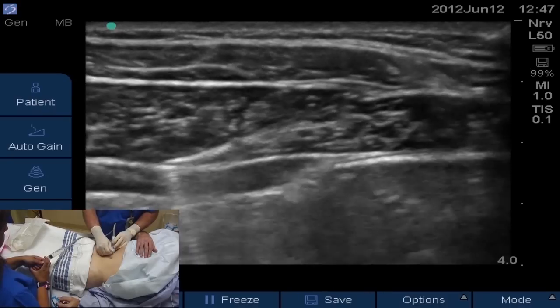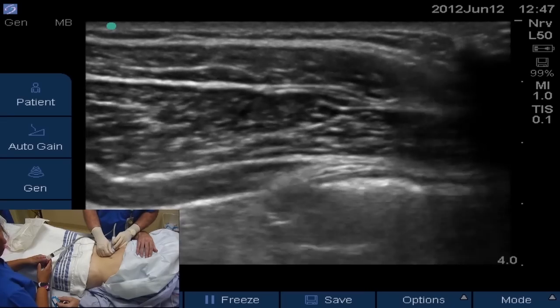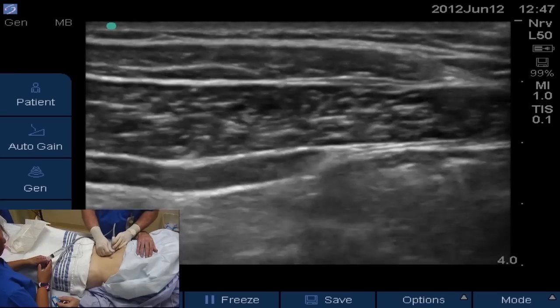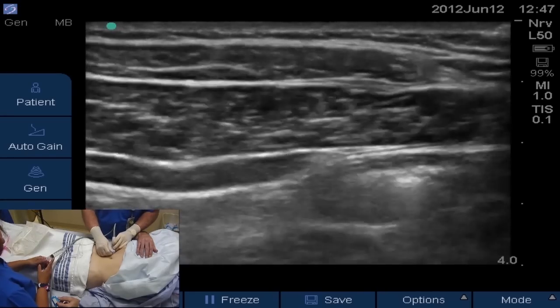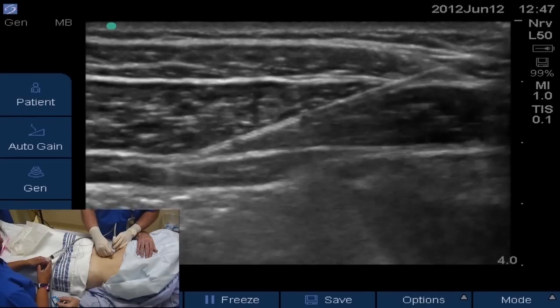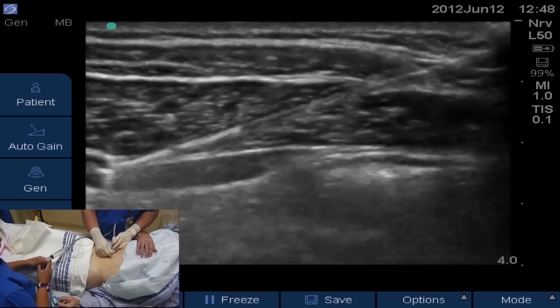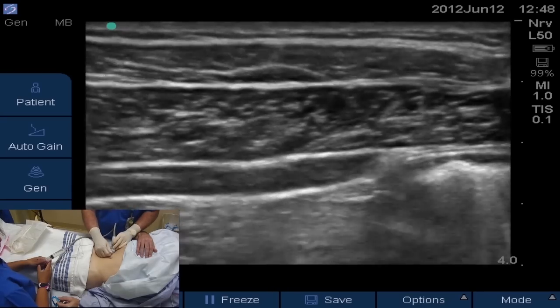It looks like we're there — but we tried to inject just a couple of cc's and you can tell it was still in the internal oblique muscle. So we're going to advance a little bit further, try to feel the pop to get in between these two fascial layers. When we start injecting, it should open right up, kind of like a river opening up.